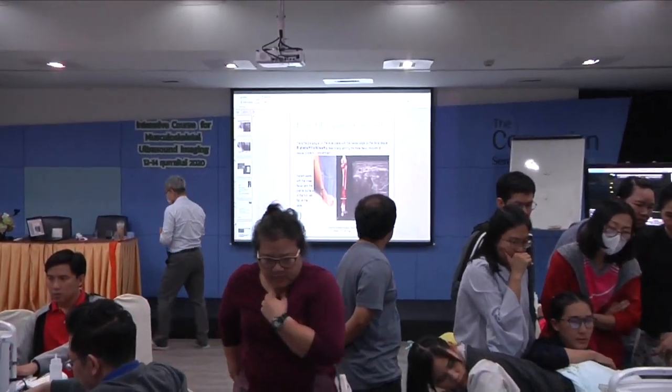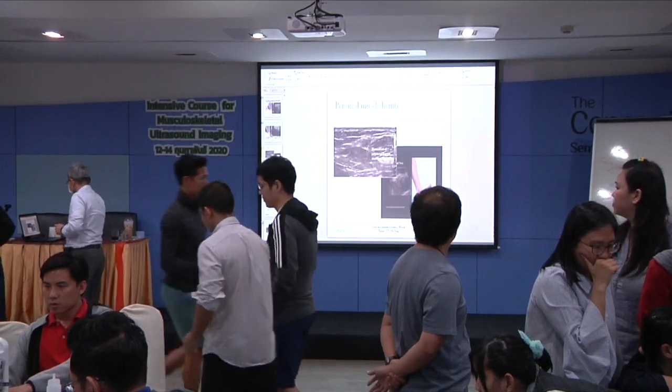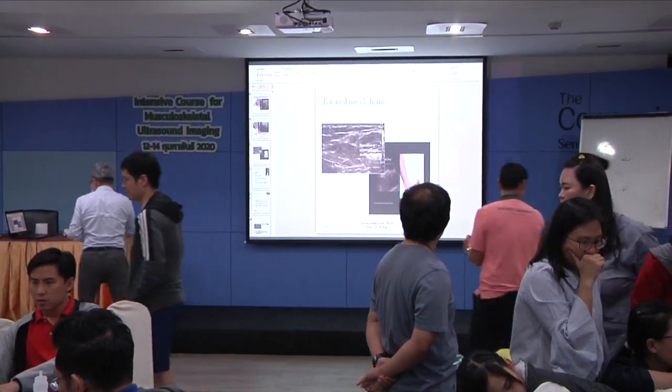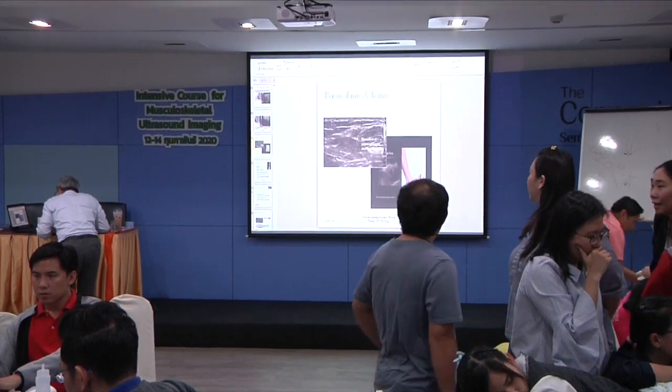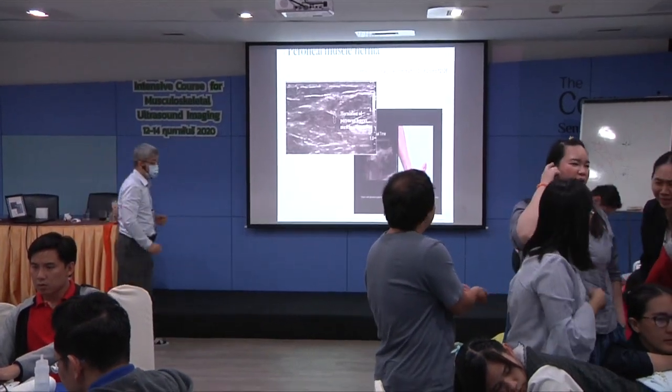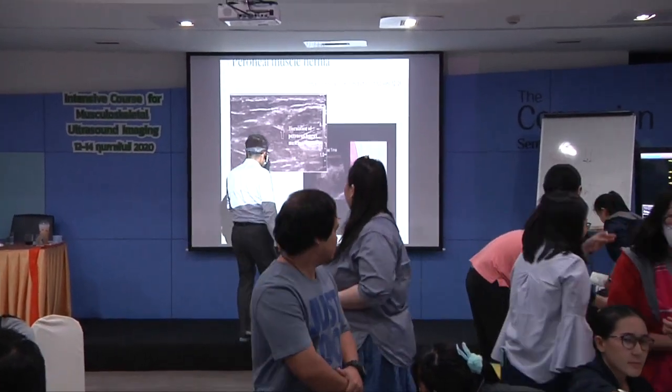And we can ask the patient to do the dorsiflexion.